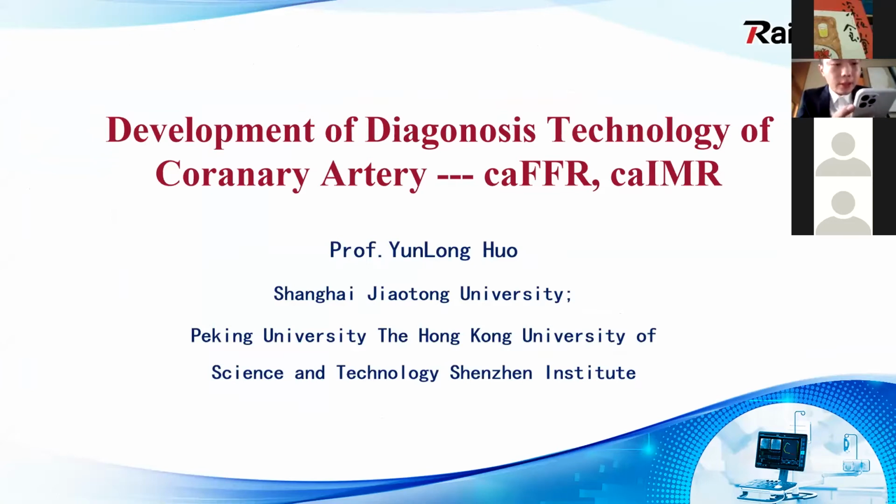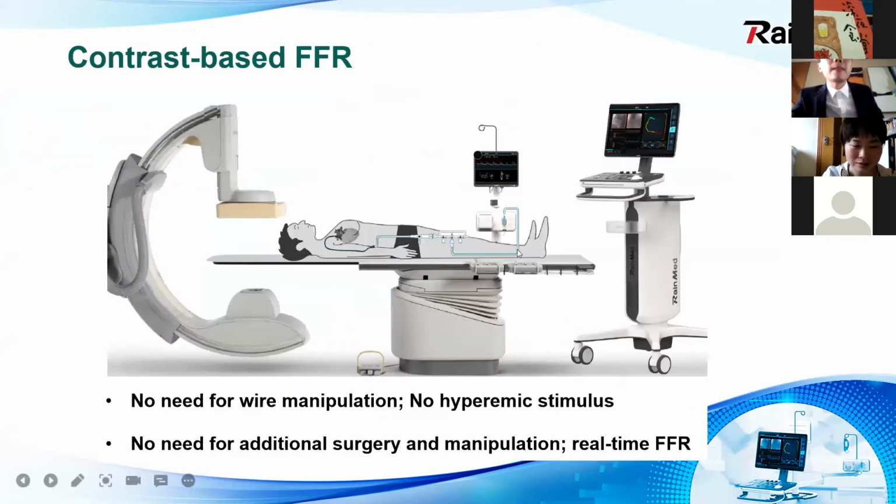Yes. Okay. I'll give a short presentation about the development of diagnosis technology for the coronary artery, called caFFR and caIMR. Firstly, here are the advantages of our caFFR, which is also based on the contrast FFR.